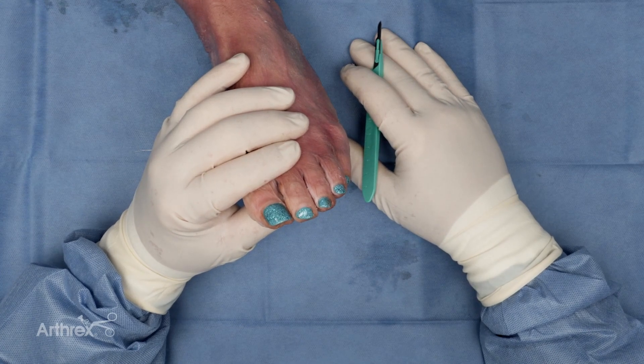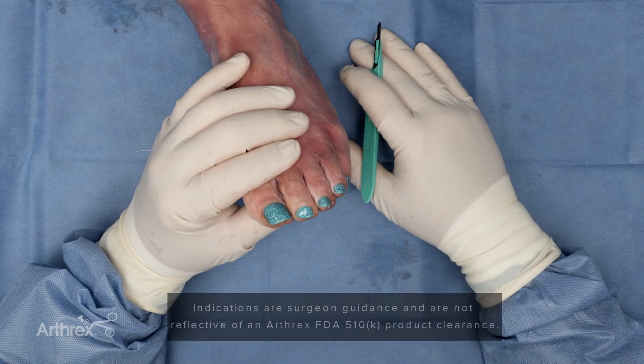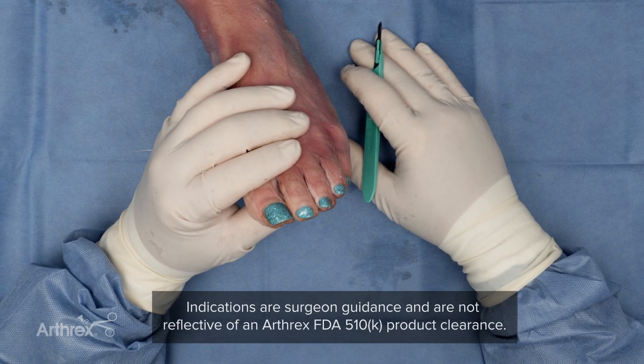Greg Horton from Kansas City. I'm going to go over a number of the different quality indications for the snap-off pin system.